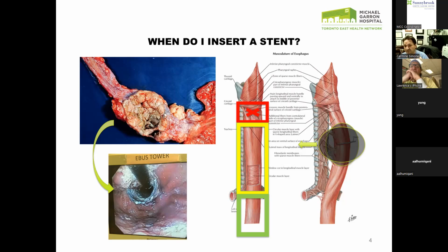So that's a retroflexed view of a particular example of a patient, and you can see the healed scar where the scope is obstructing there. In this case, there's a patient who had a GI bleed after their stent insertion. So you palliate their dysphagia, but unfortunately, you're giving them different problems. And so anything in the middle third and distal third of the esophagus is probably best for the deployment, but the stents are always fraught with complications.